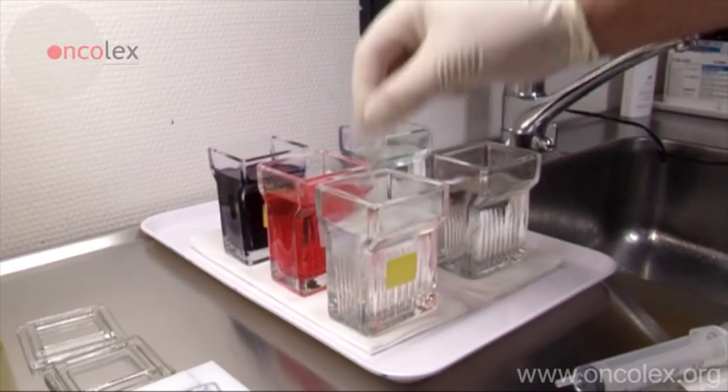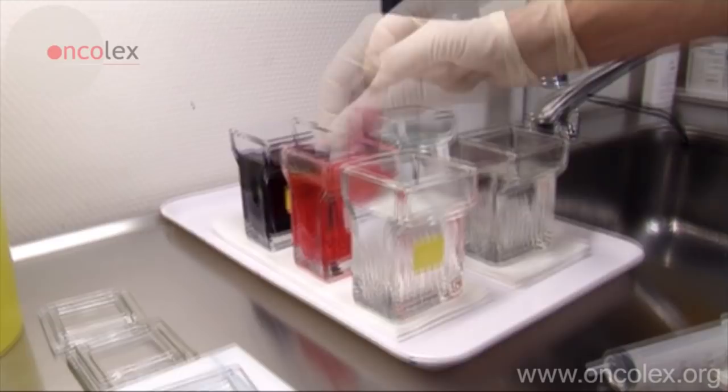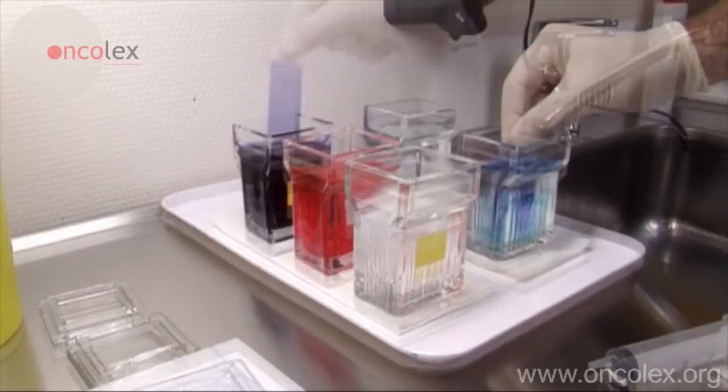The material is first dipped five times in fixing fluid with methanol, then three times in the first staining bath and six times in the other staining bath, before rinsing in two baths of distilled water.